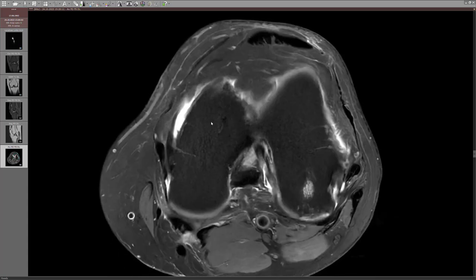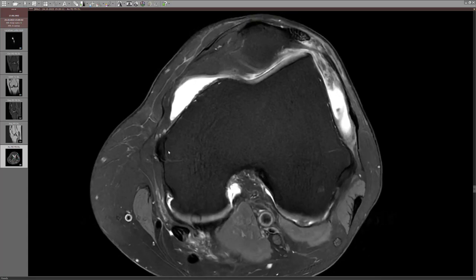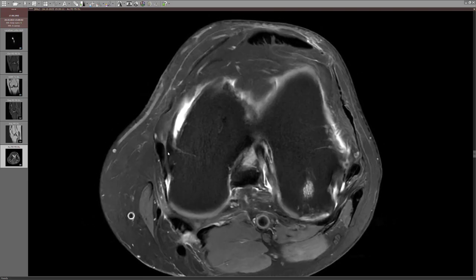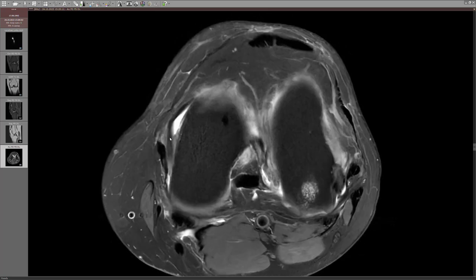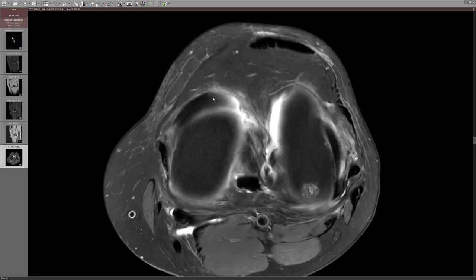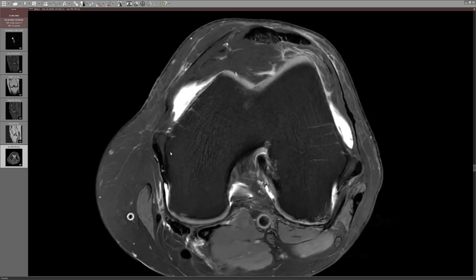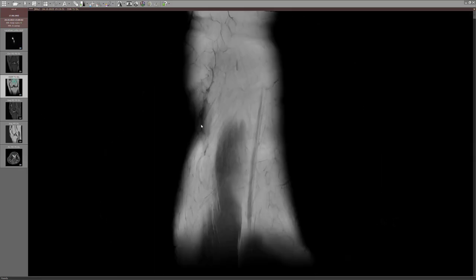On the axial images, going high up to the origin, we see some thickening and additional tissue. Then there is this thick origin, and a band that goes this way — we know this is not the normal deep MCL course. It blends in with the anterior horn of the meniscus. That confirms this is the fascicular capsulofemoral band.